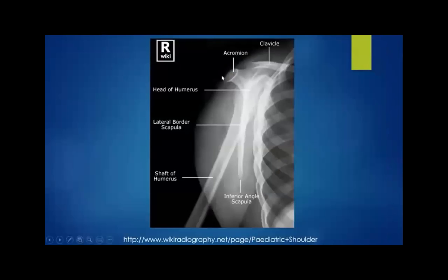So here's our acromion, the back part of the scapula. And you can kind of see this part over here coming up, not the clavicle, but the coracoid process over here. That's the V part of the Y. Oh, here it is. Sorry, I was tracing the wrong bone. And the scapula, this corner here angle, and the humerus coming down. So they kind of move the humerus a little bit out of the body. It should be laying straight over the scapula.